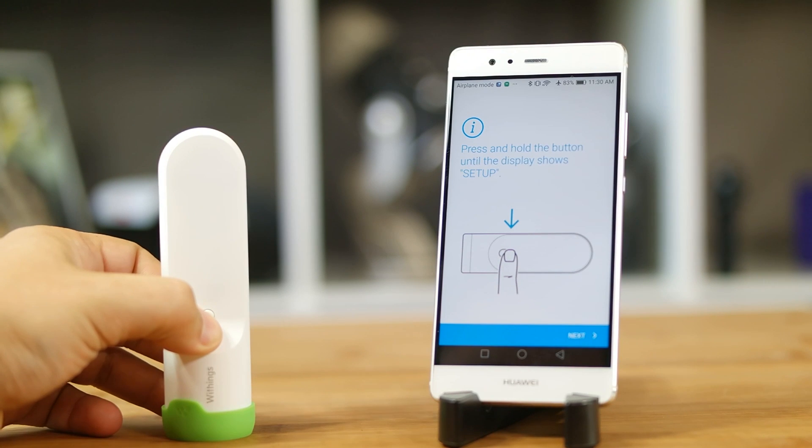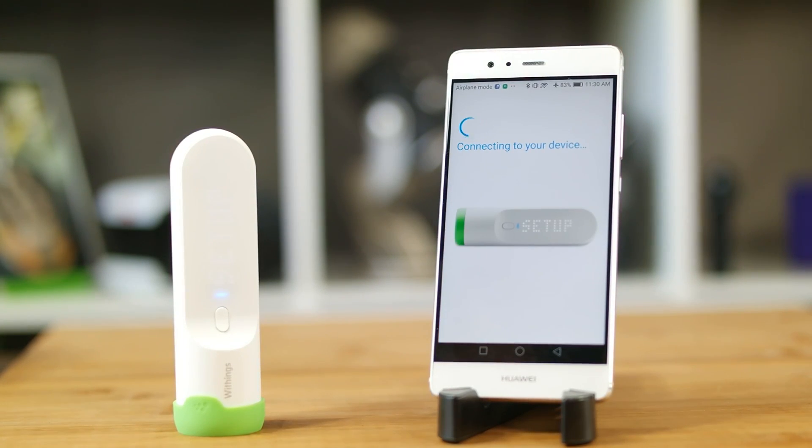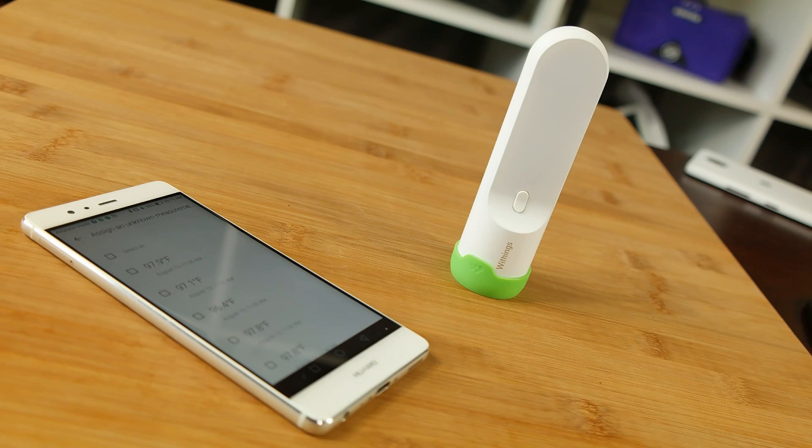In all, this is a sleek, cool, premium health-focused accessory. Adding a data connection to something like a thermometer is certainly novel, and the speed of the scan is helpful when dealing with a fussy child.